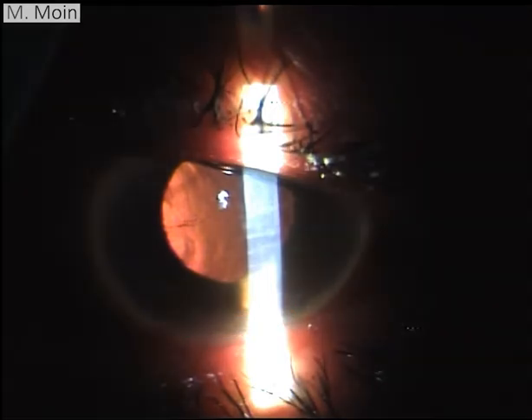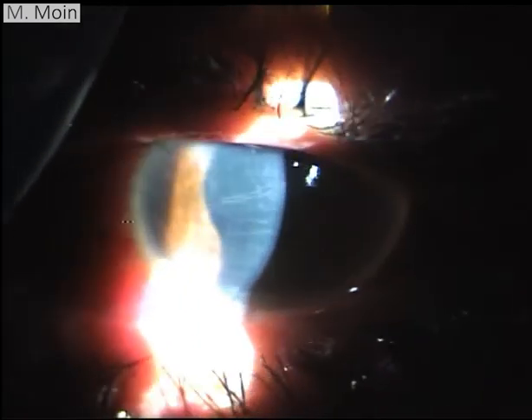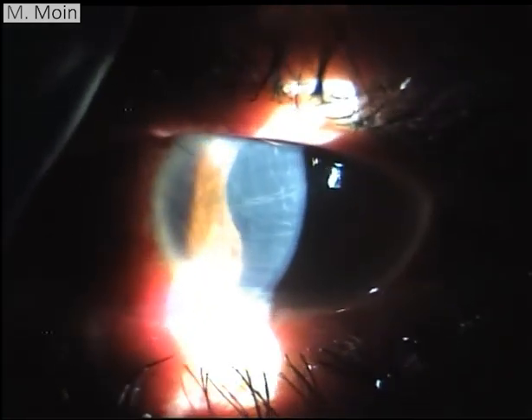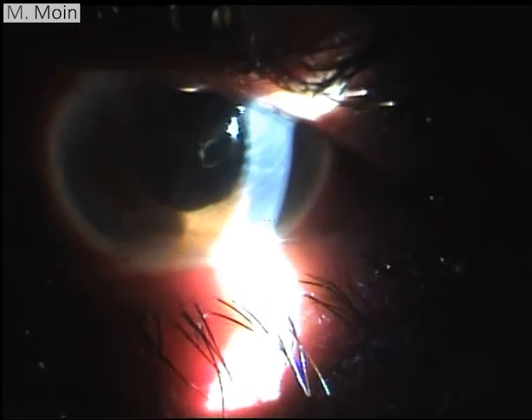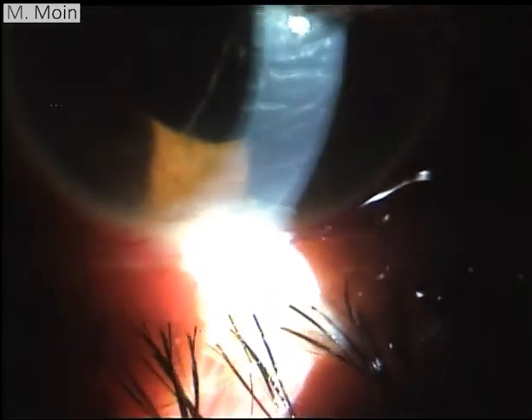Let's go forward and move the slit to the side, and then you can see the same things. The patient is aphakic, so you do not see any reflection from the surface of any IOL. No IOL is present, so you do not see any reflection in that area.